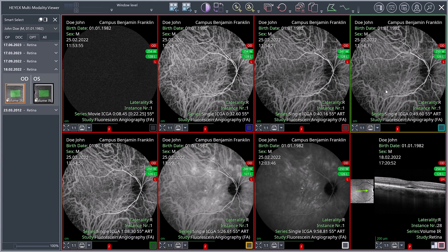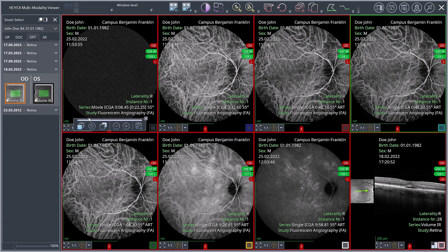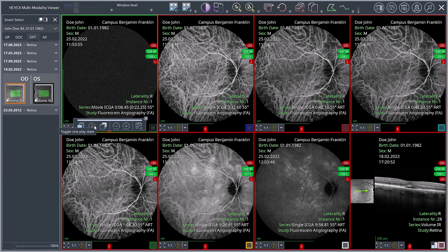The first viewport contains a video of the early arterial phase. Click on the small arrow in the quick access toolbar and activate the cine function. The cine toolbar is displayed in the selected viewport. Click the play button to start the video.